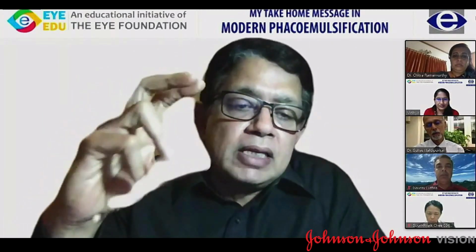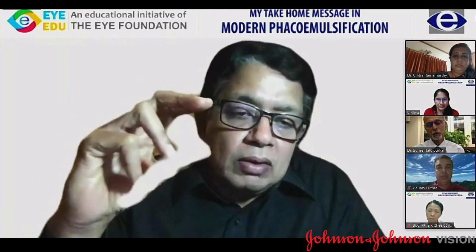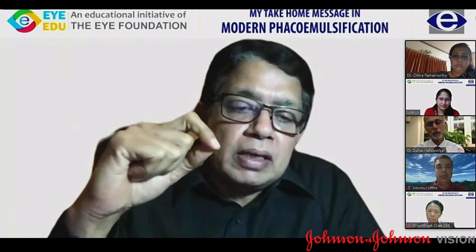And even in these small eyes where there's a 4 millimeter anterior posterior diameter of the normal lens, you have enough space to put in 2 intraocular lenses. I think that gives you extreme accuracy.